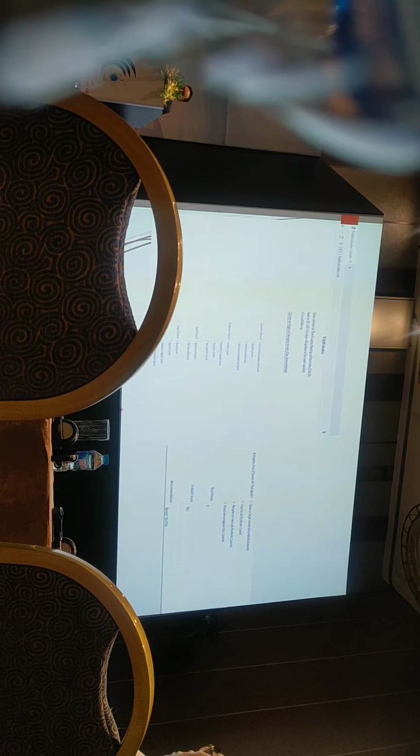If you click on this website, it shows the 5 parts of the TI-RADS classification, including composition, echogenicity, shape, margin, and echogenic foci. We can choose each item, and then it will calculate the total points. It will transfer to the TI-RADS level and also show the recommendation. Sometimes we cannot remember which parts of the sonography features, so this website will show you each of the sonography features.